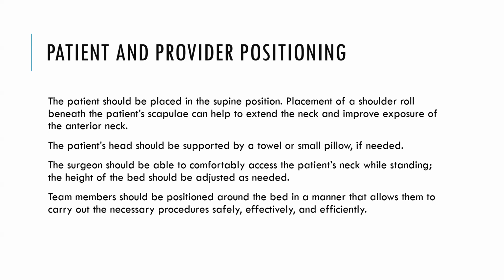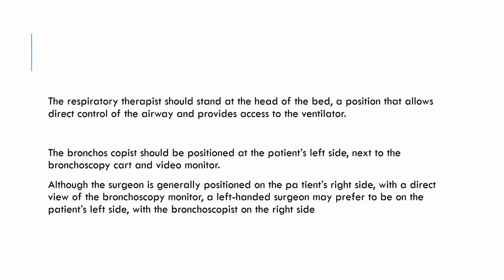Team members should be positioned around the bed in a manner that allows them to carry out the necessary procedures safely, effectively, and efficiently. The respiratory therapist should stand at the head end of the bed, a position that allows direct control of the airway and provides access to the ventilator.